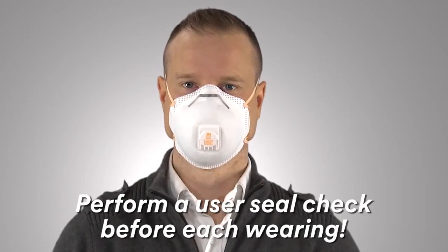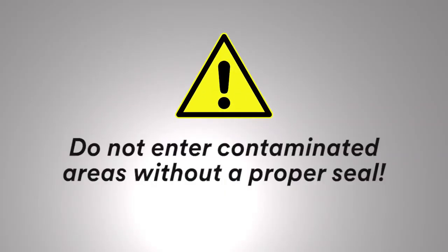To check the respirator-to-face seal, place both hands completely over the respirator and inhale sharply. Be careful not to disturb the position of the respirator. A negative pressure should be felt inside the respirator. If air leaks around the nose, readjust the nose piece. If air leaks at the respirator edges, work the straps back along the sides of your head. If you cannot achieve a proper seal, do not enter the contaminated area.